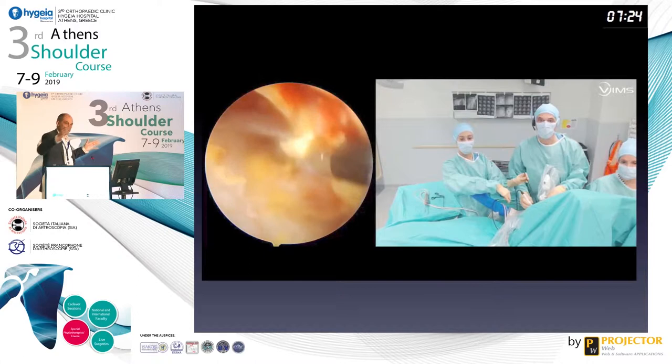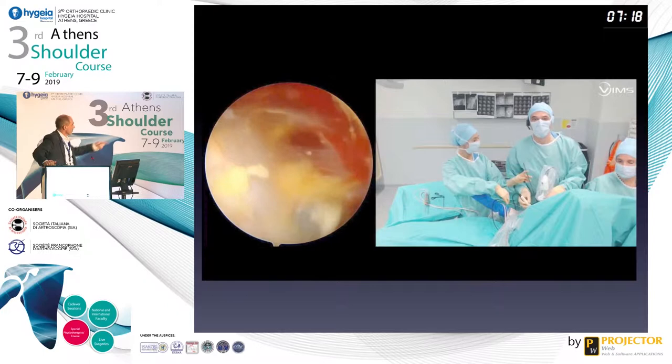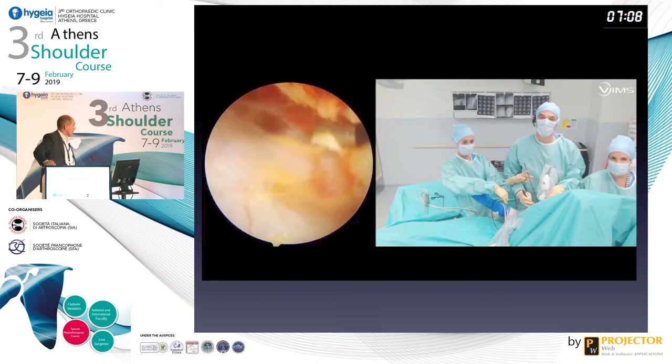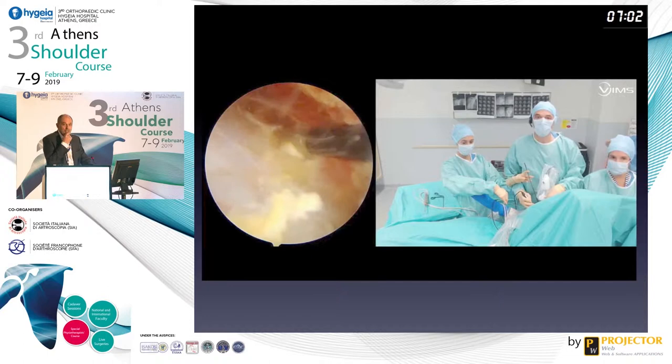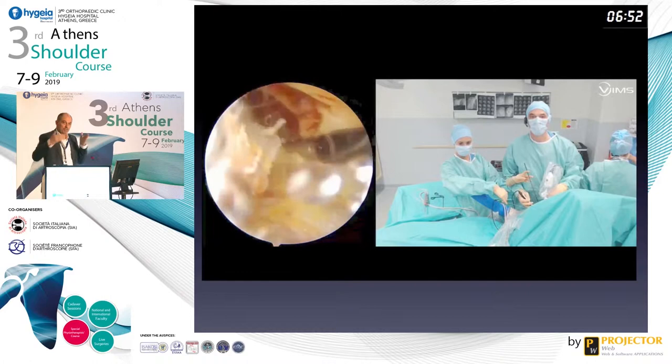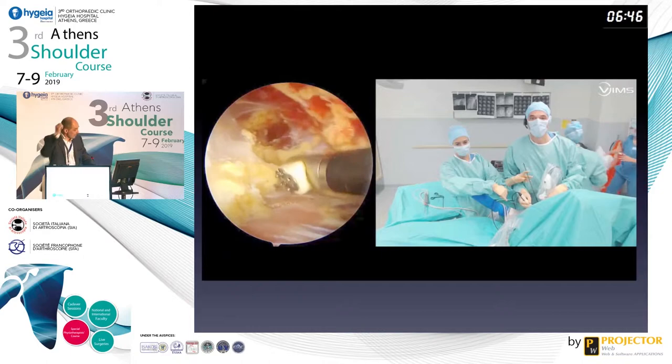And to go over, it is very important, because you can see here the transversal connections from the lat dorsi, which is sagittal, and the transversal connection, which is here. I am making the dissection. Why? Because this is a natural connection between the lat dorsi and the long head of the triceps. If you don't cut that, you will not be able to lift up your tendon. So it is very, very important to understand that, and to understand that there is a 90 degrees orientation between the fibers of the lat dorsi and the fibers of the fibrosis of the long head of the triceps.